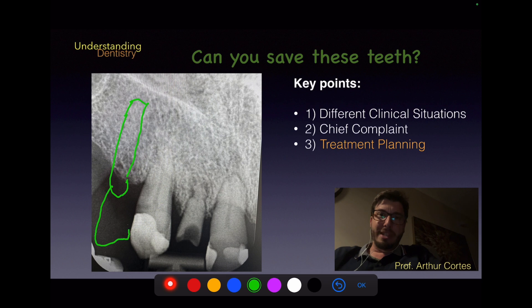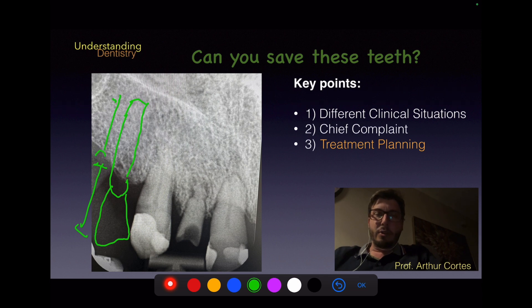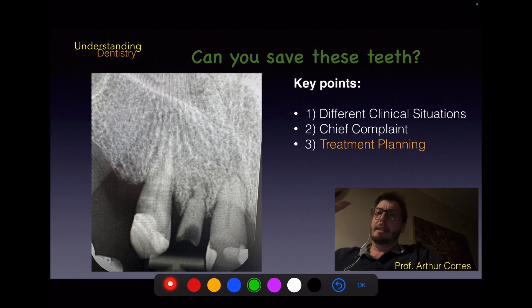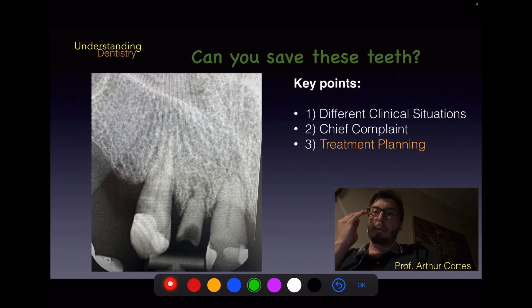For dental implant planning in this region: there appears to be sufficient height, but consider the abutment plus crown — the crown would be very long. A very long implant would also be needed. Of course, implant planning requires a CBCT, especially given the palatal bone concavity in this area.